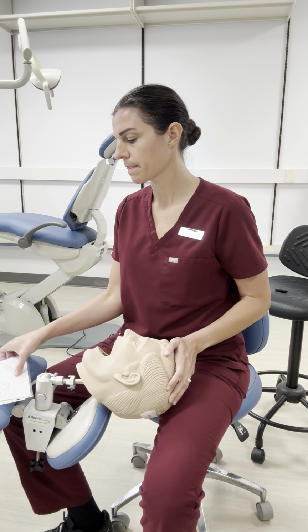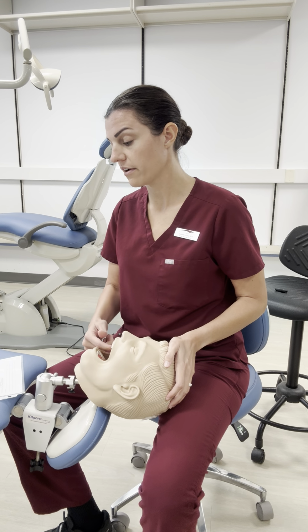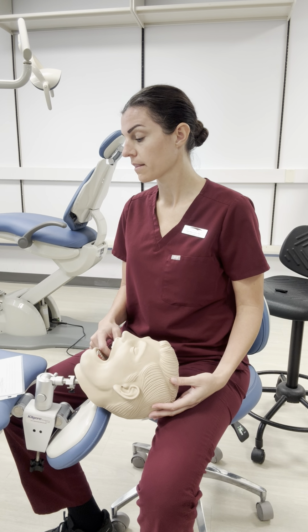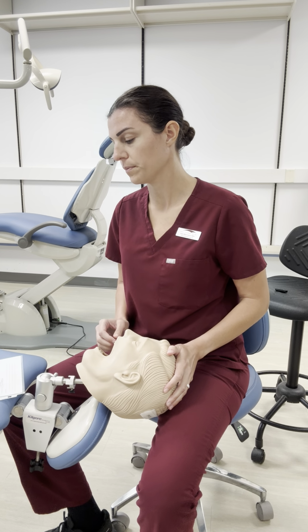Okay. Then we have maxillary right lingual. Okay. So those are the surfaces on the maxillary, right side, on the lingual or palatal side. I'm again going to be at this 10 to 12 o'clock position. The patient's going to be chin up and towards the operator. So same positioning as the maxillary left buccal.